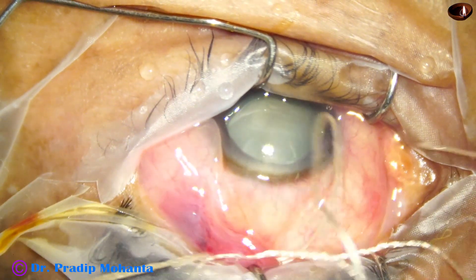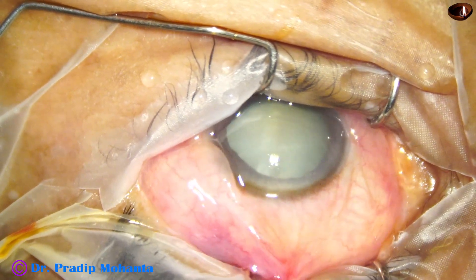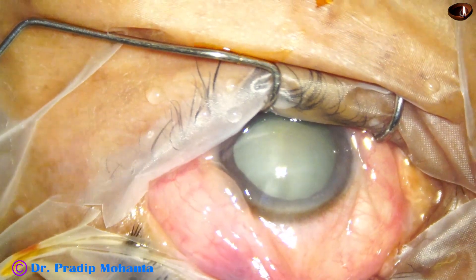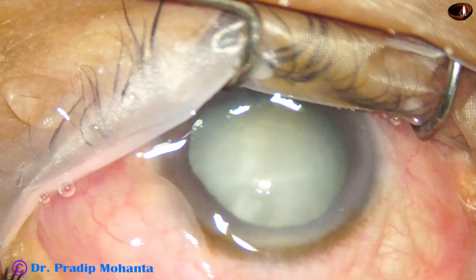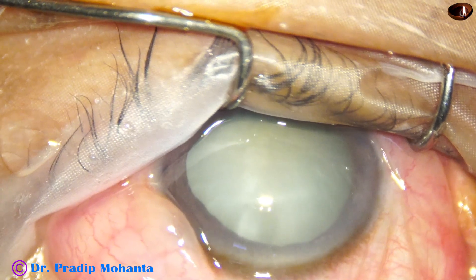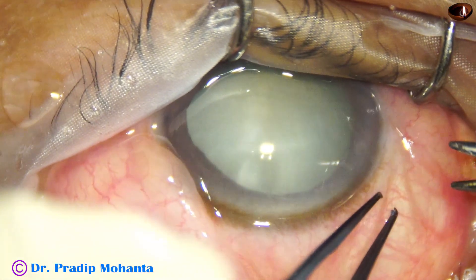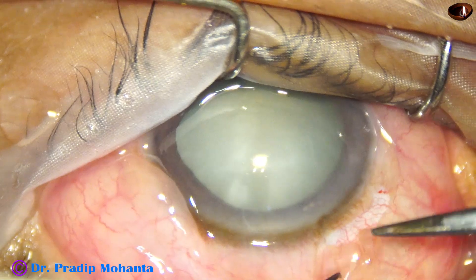I was not sure that I would be able to do phacoemulsification in this case, so I am getting prepared for conversion to SICS. This is a superior rectus bridle suture. I am going to do a peritomy also because there is chemosis of the conjunctiva, and I was on more chance of doing SICS than phaco in this case. That is why I did peritomy also, and this will reduce the chemosis.